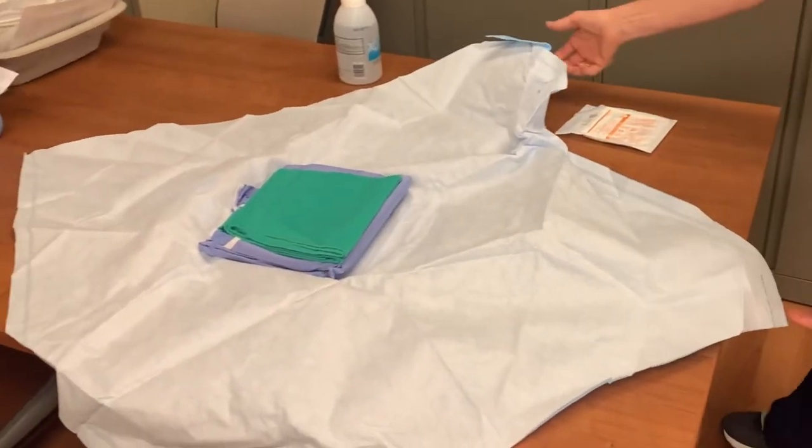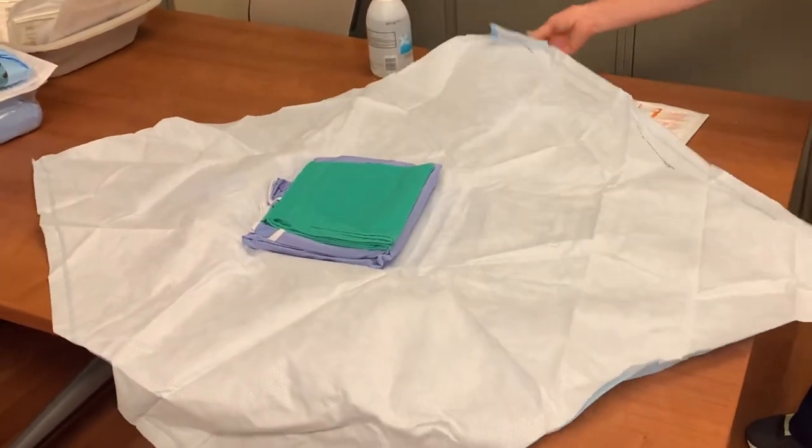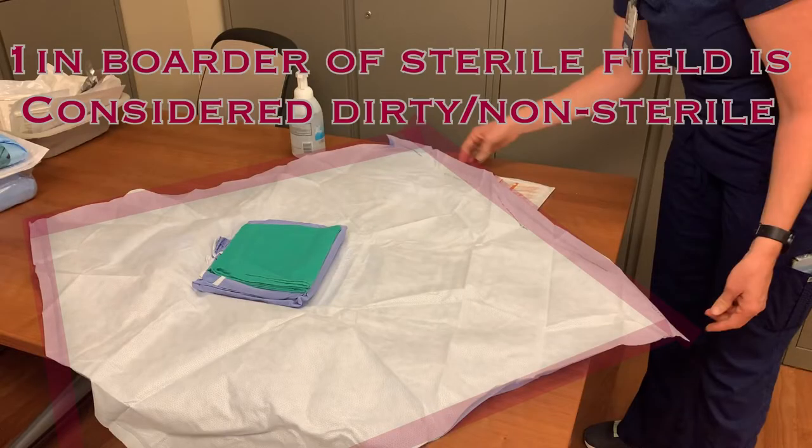The open white surface is now your sterile field, with the exception of a 1-inch border around the edge of the field. No sterile supplies should touch this 1-inch border, and if they do, they will be considered contaminated.